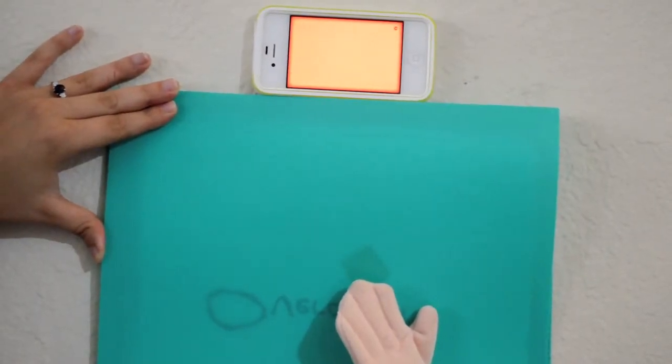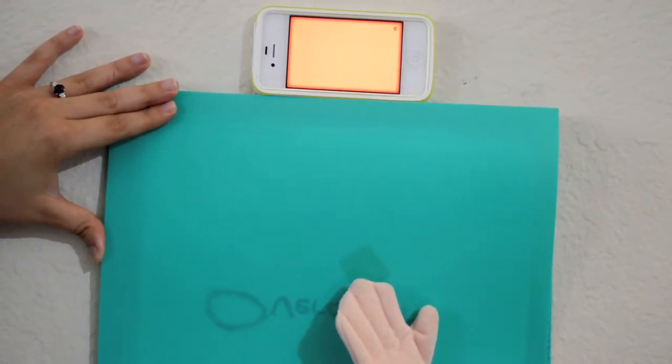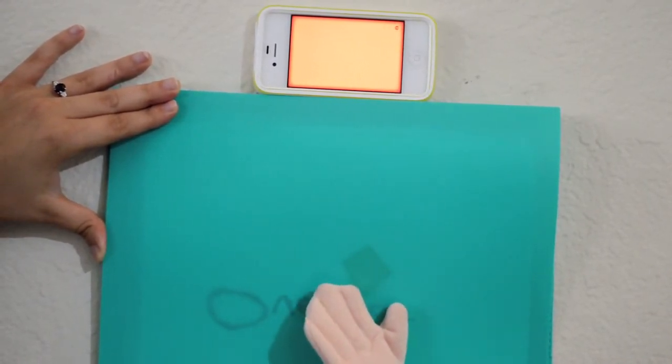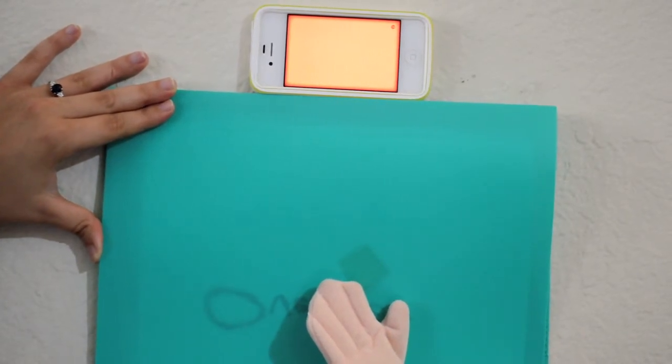This specific film is orthochromatic, meaning we must use a red filter light while handling and developing. This particular film was stored in a cool, dry, dark storage bin to minimize film fog and other artifacts.